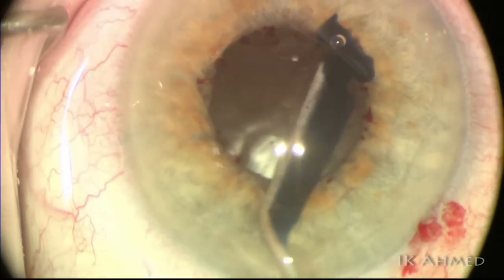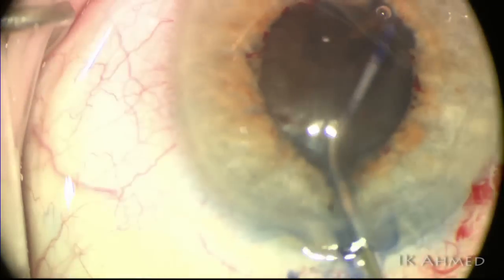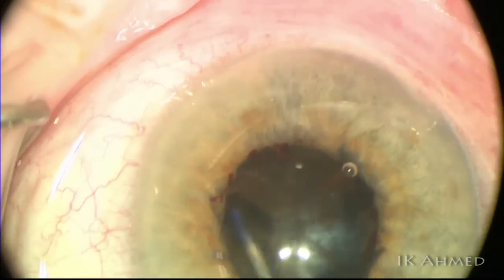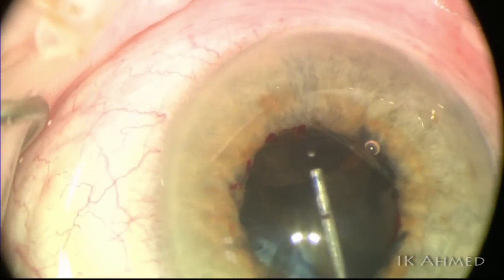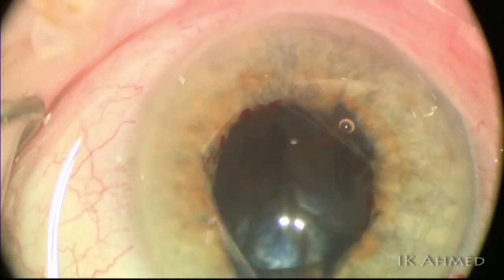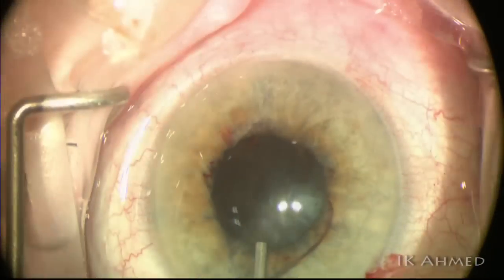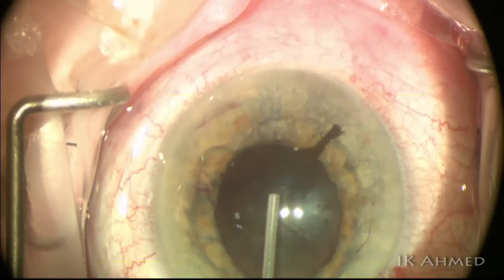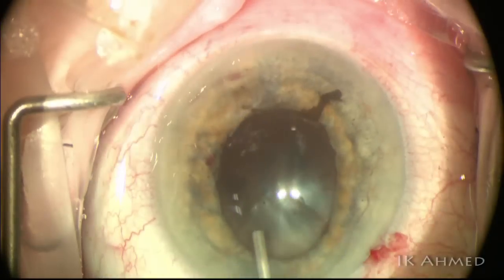We're now going to inject some Tri-Pan Blue under the cohesive viscoelastic. We like this technique after the synechiae have been released. We find it quite controlled to inject very lightly — really painting more than injecting — to stain an adequately sized capsular space.